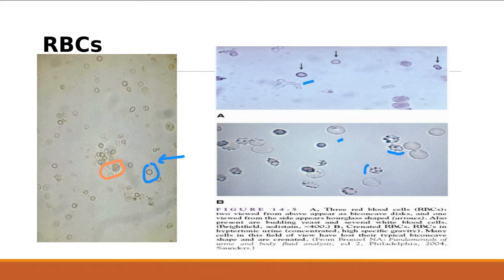If you recall what cells look like on a hemocytometer or when you did a wet prep, we talked about those in body fluids and hematology, and we'll talk about them a little bit more this semester too, but that's what they look like. So it's a good thing to compare them to because those were unstained cells as well.